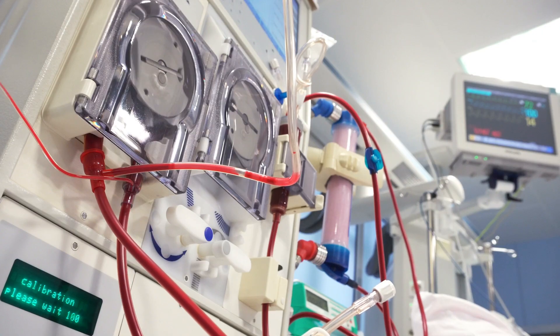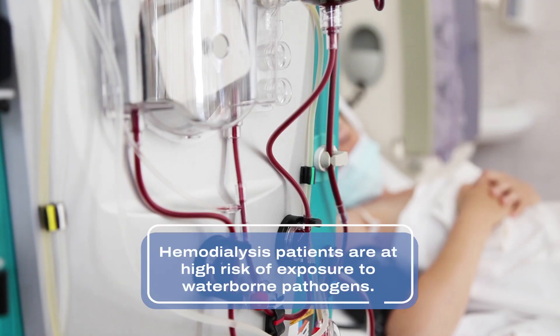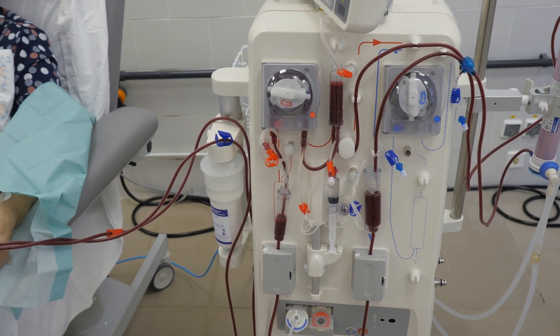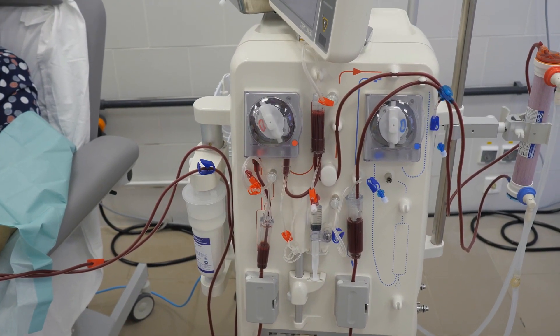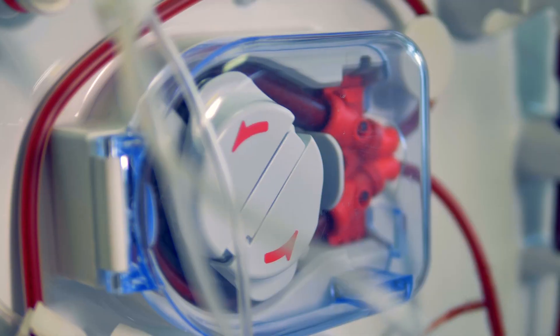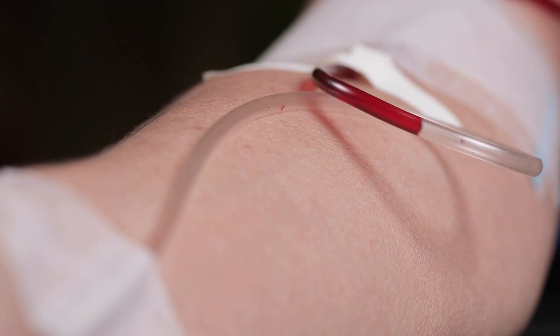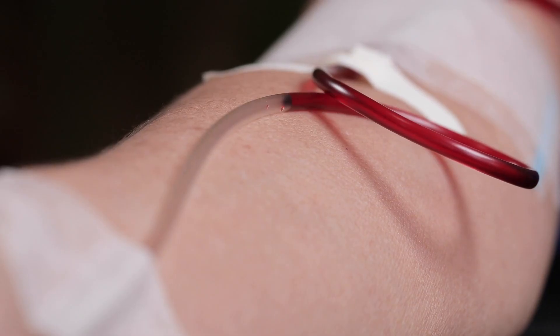On average, a hemodialysis patient can be exposed to 300 to 600 liters of water per week, putting them at a high risk for exposure to waterborne pathogens. Repetitive exposure to chemicals or microbiological agents present in hemodialysis fluids can cause serious harm to patients, including bacterial or fungal infections, chemical intoxication, hepatitis, and gram-negative bloodstream infections.